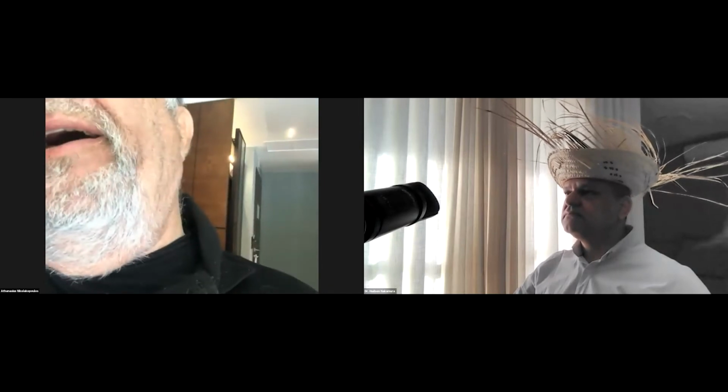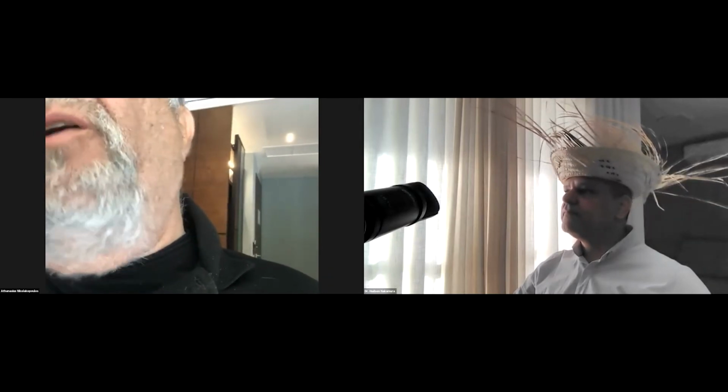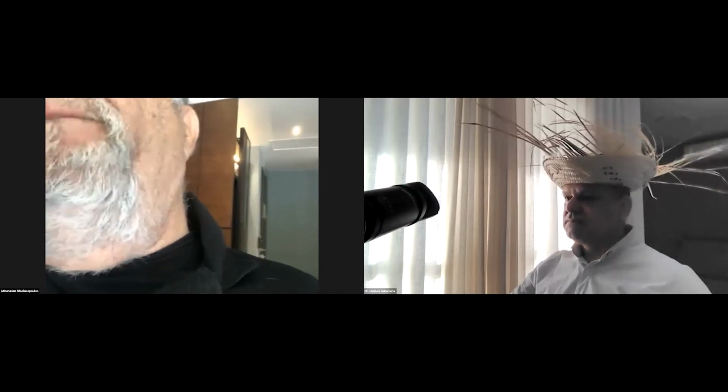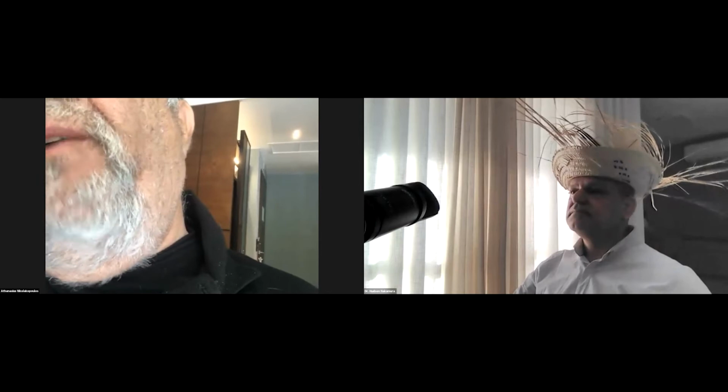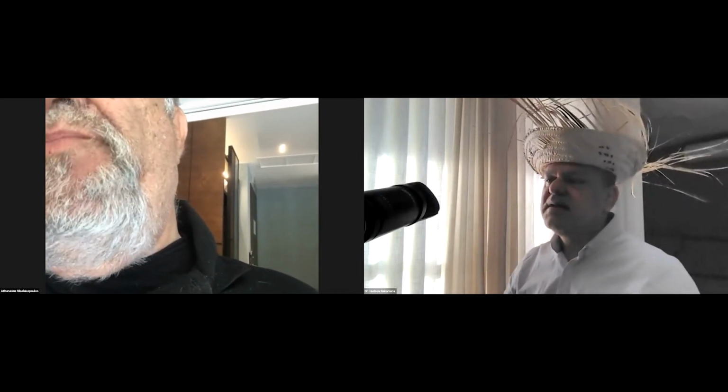So fishing a nucleus while it's ready to drop, better leave it down there and we'll take it very easily. Otherwise, we have to fix things that are going to be damaged by the surgeon. I think it's surprising for us, and I hope it's surprising for you, and its take-home message is strong. Thank you. Yeah, great case.